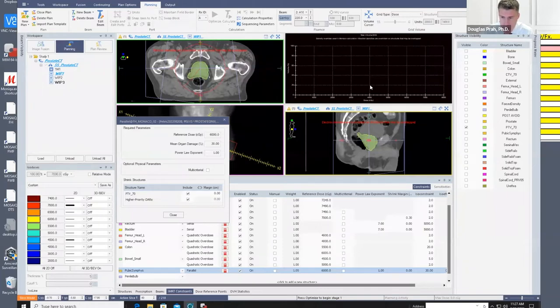So if we use a value of, like, a value of four, and we put in, well, here in this case, it's 6,000. So the bulk of the impact is going to be around here, and it's going to put pressure on the curve here. And this is for, I guess they call it a K, like a K equal four. Now, if I come in here, can I switch the color in here? I'm not sure if Zoom will let me switch that. So let's clear. And then I'm going to come back in.